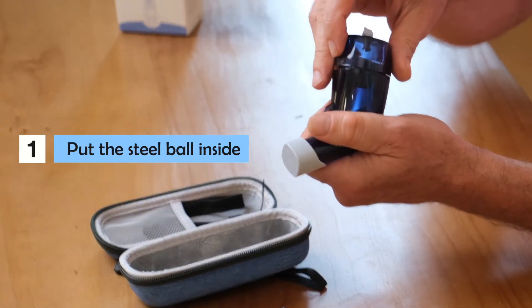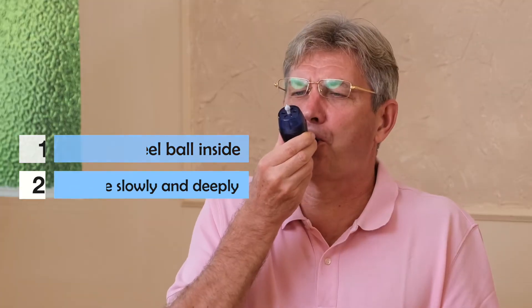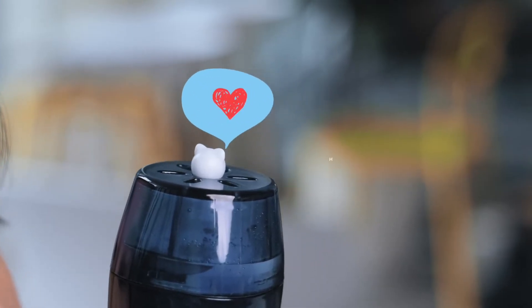Put the steel ball inside the upper part, take a deep breath, and exhale slowly and deeply. You can see the cute little bear jumping and floating. Have fun with it!